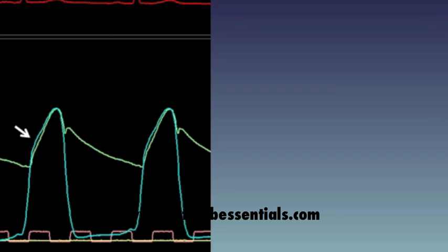Pressure rises with contraction isovolumetrically until the aortic pressure is reached, at which time ejection then opens the aortic valve, and blood is ejected out of the LV. You see the anacrotic shoulder noted by the arrow and a small impulse gradient, which is normal in all people.